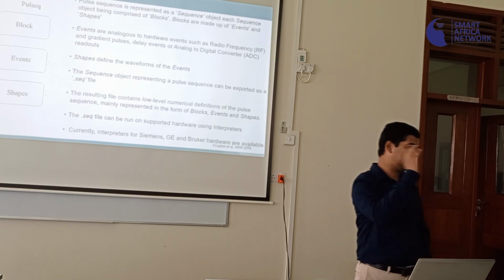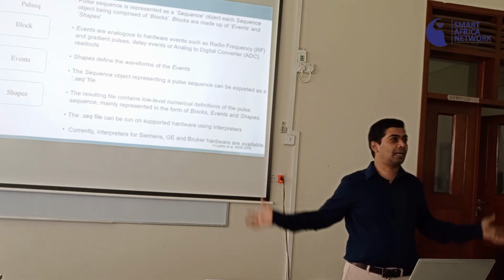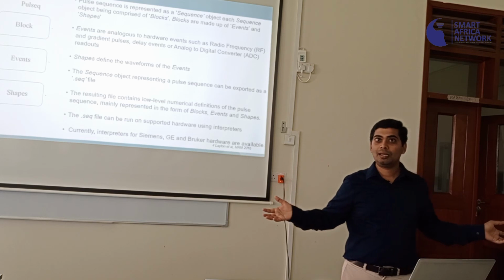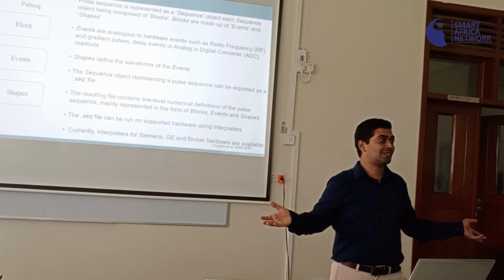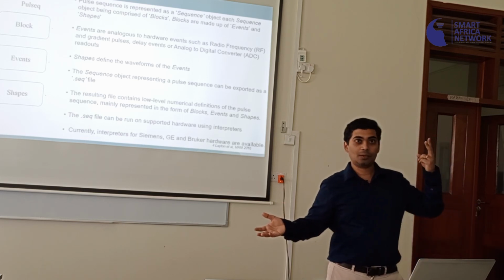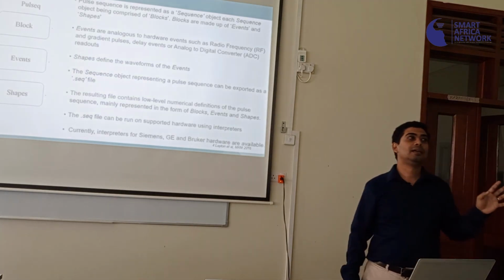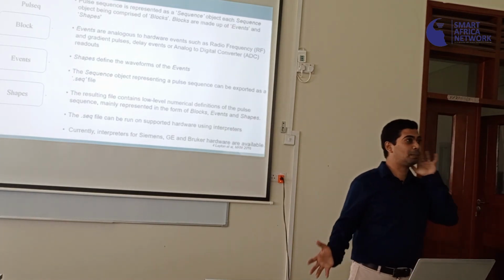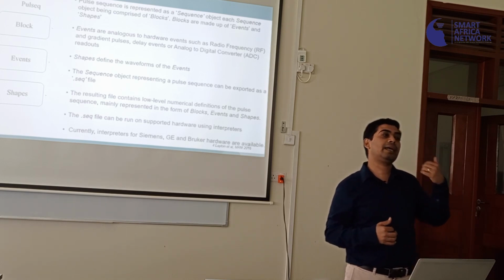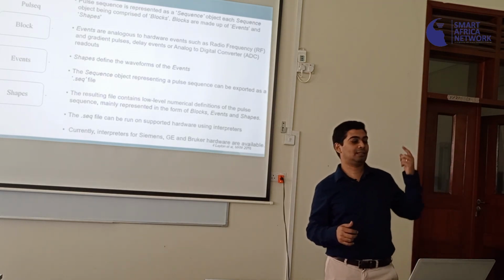Once we turn on the magnet, it produces a magnetic field. Right now we are actually in a big giant magnetic field called the Earth. So people do MRI using this planet as well. It's called Earth field NMR and MRI. You can build one for $200 US. And there's a paper on it by Carl Michal from University of British Columbia. True story. So we are actually in a big magnet right now, and the protons in your body are either aligned to or opposite to the north pole of the Earth's magnet.